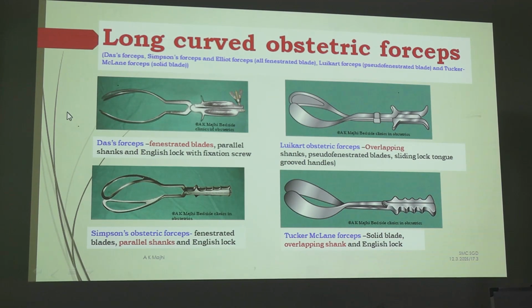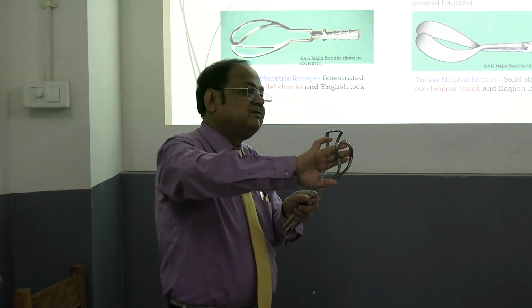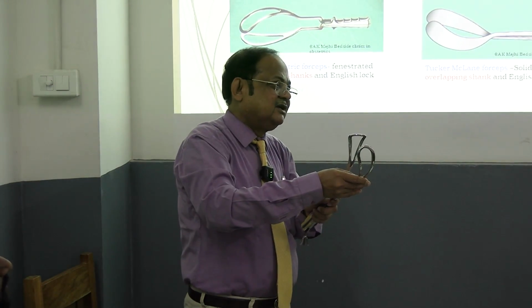See what differences there are here. This is the fenestrated blade, but it may not be fenestrated; that is the solid blade. There may be a solid blade.